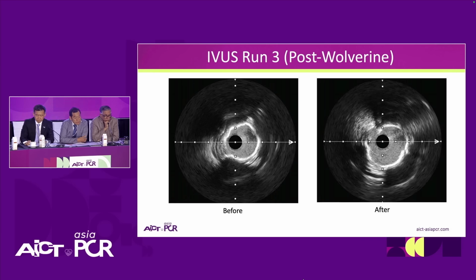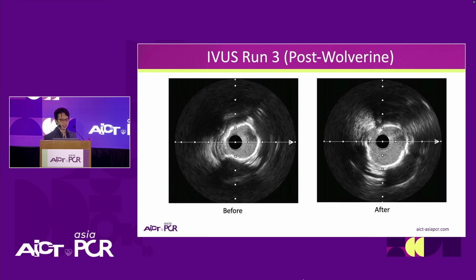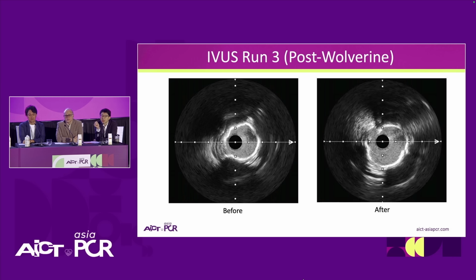And I think maybe, Jason, you were commenting on where the fractures are seen and the reverberations, the location. Yes, this is a very nice slide which shows where the three cutting elements are, really applying that focus force that Dr. Nartip showed us in his earlier slide as well. So you can see the nice effect from Wolverine.